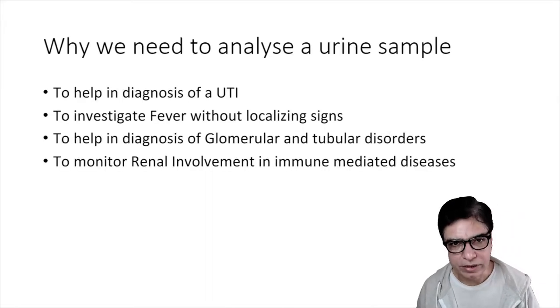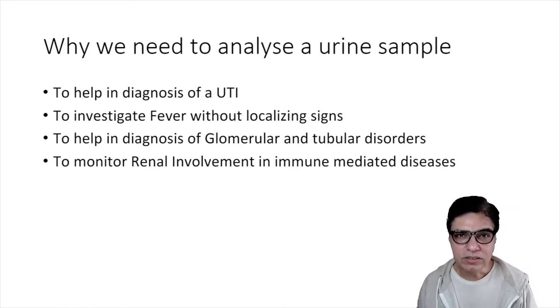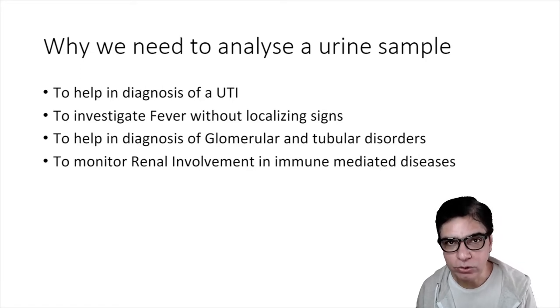So the first thing is why we need to analyze a urine sample. As I told you, it's a very common bedside procedure. Now, the reasons that we need to analyze a urine sample is, first of all, a urine dip actually helps us in making a diagnosis of UTI.